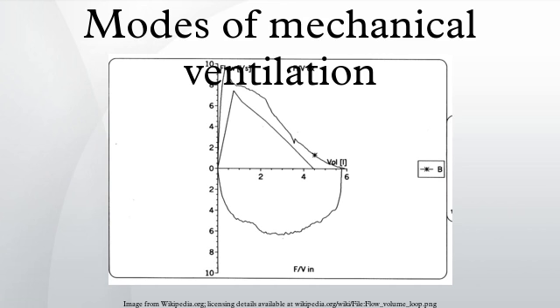Dependent, negative pressure controlled. Negative pressure ventilation cycles by producing a negative pressure around the chest and abdomen. Negative pressure moves across the chest and diaphragm and causes air to move into the lungs in the normal fashion. When the negative pressure stops being applied, the chest returns to atmospheric pressure and the inspired air then is exhaled.